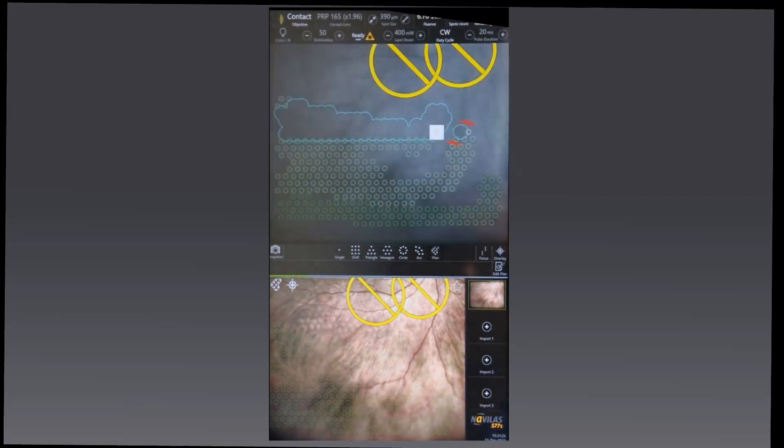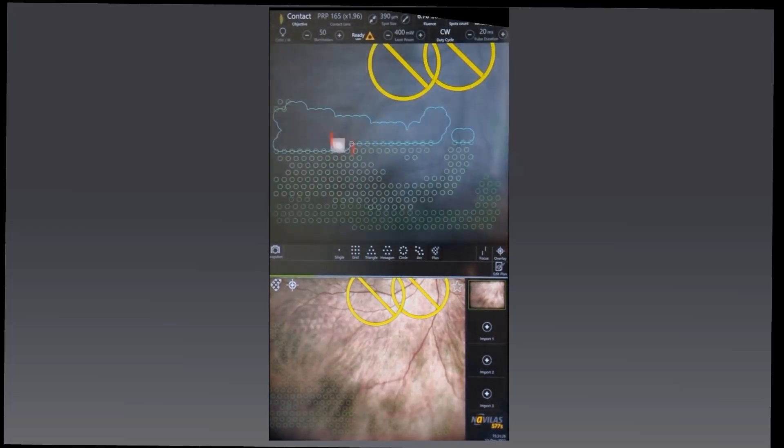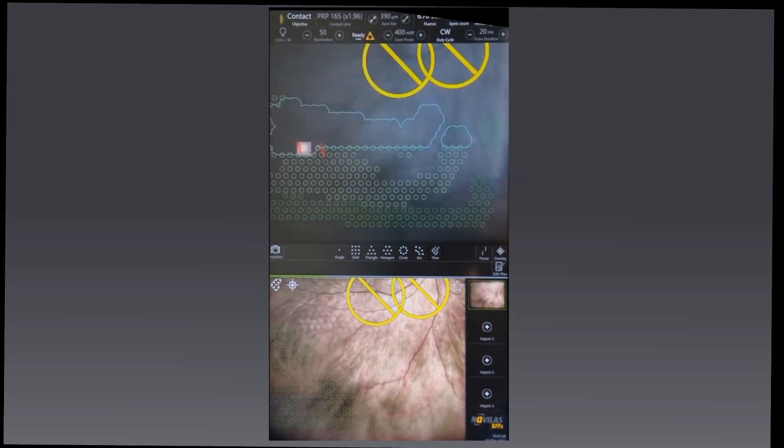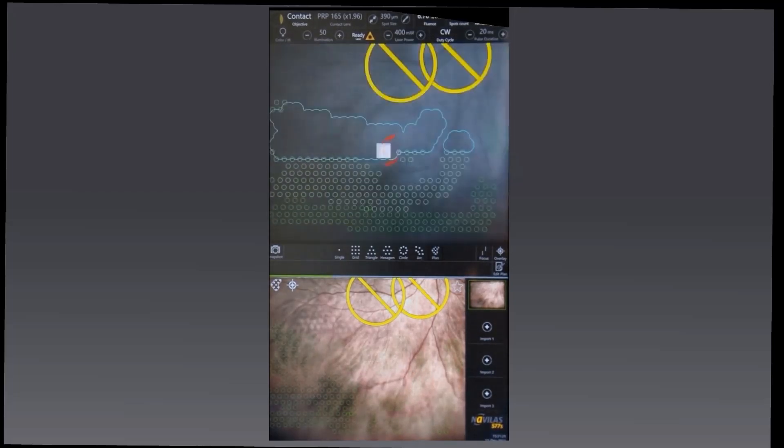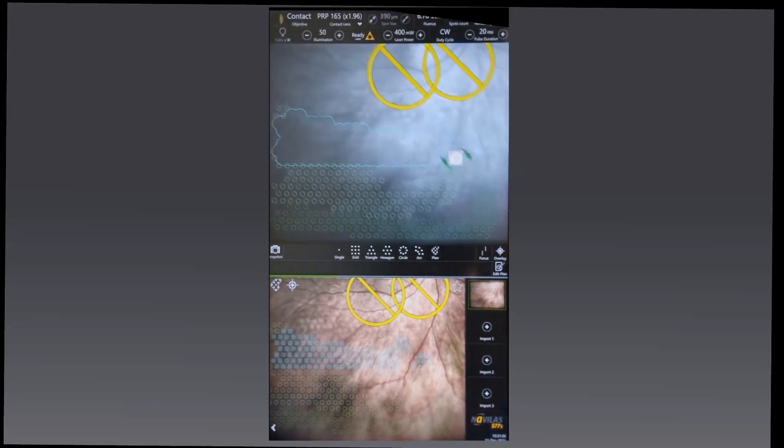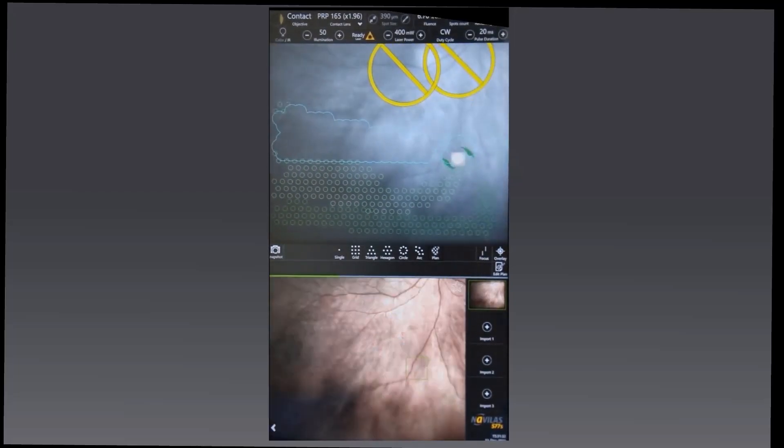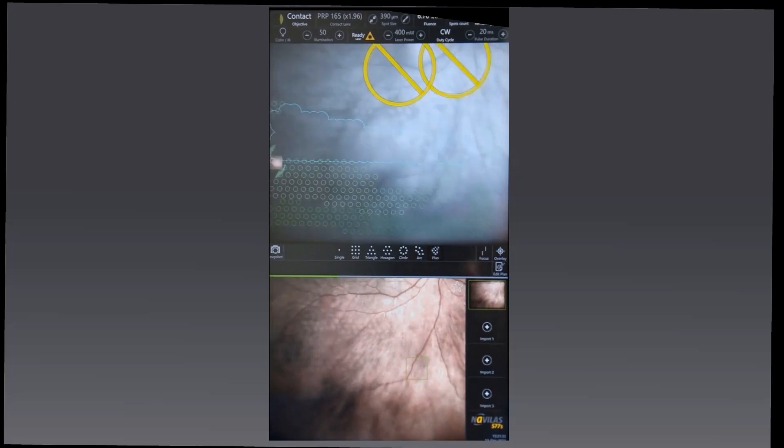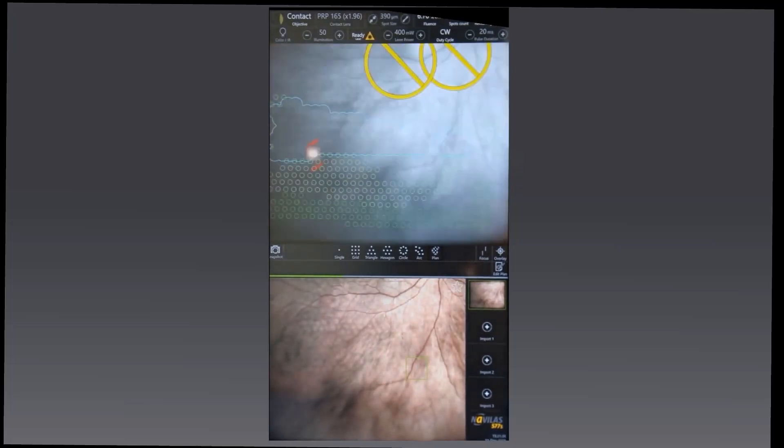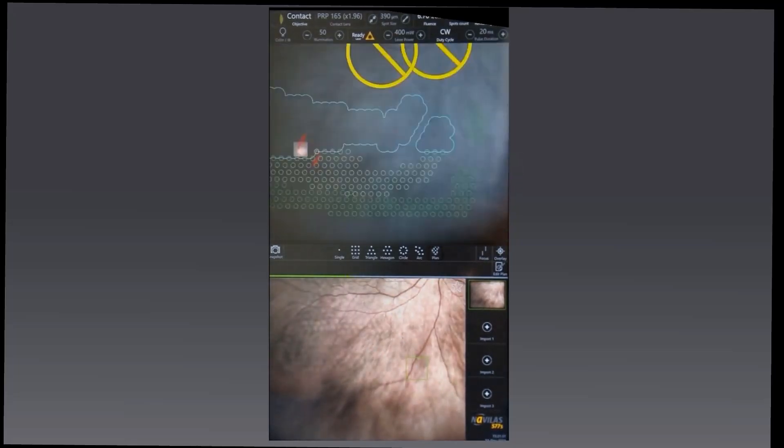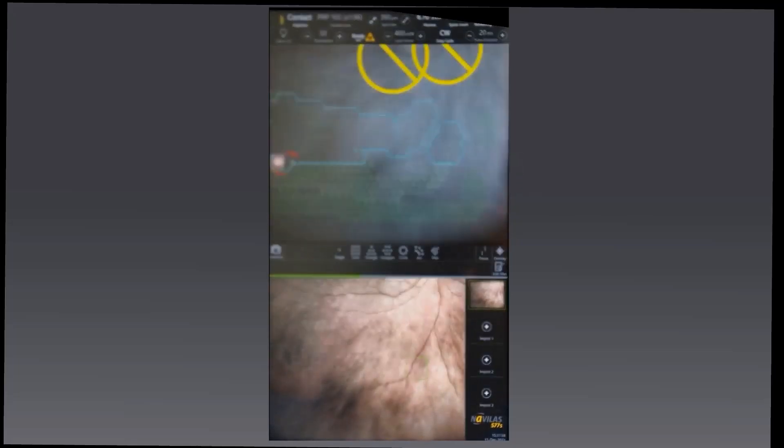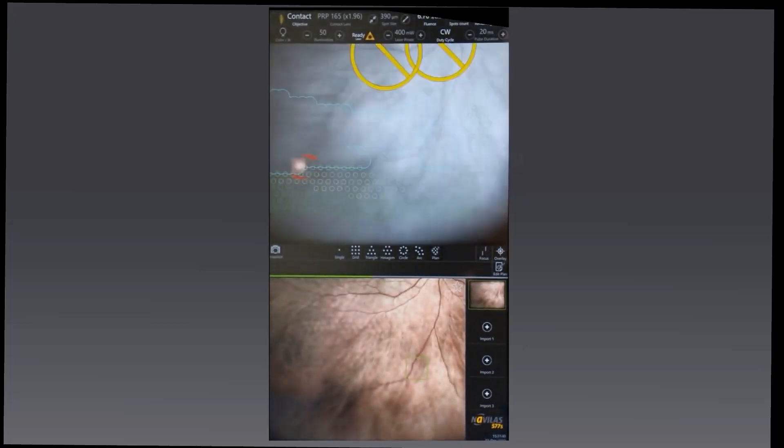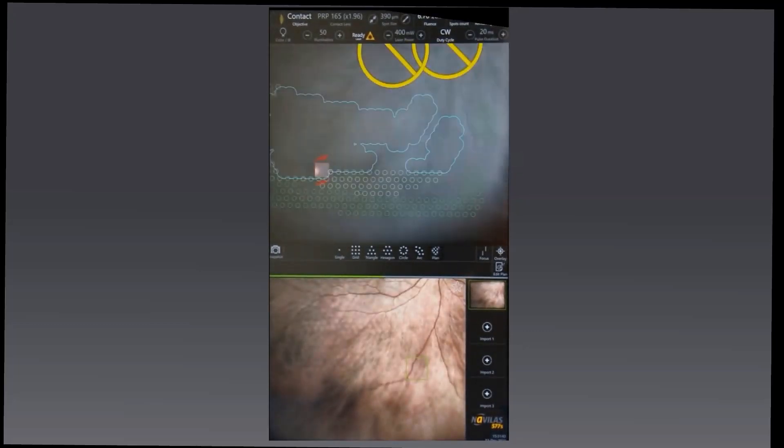In total, the treatment number of shots, slightly obscured at the top of the screen there, is around 1,300 in this single sitting in just a few minutes. As you can see, there's very little movement and very little pause in between, so the patient's tolerating it incredibly well.